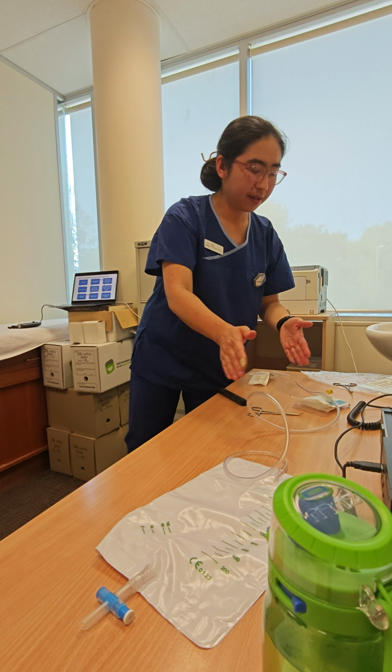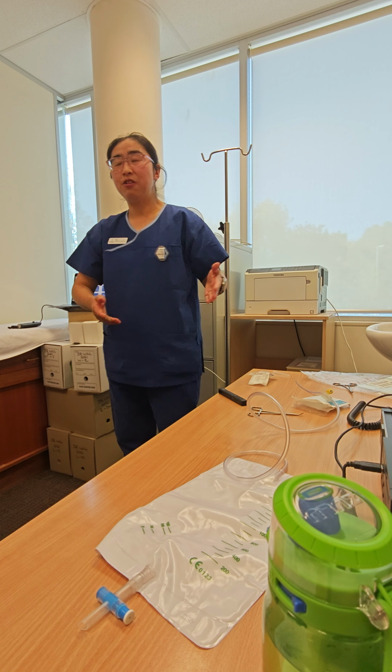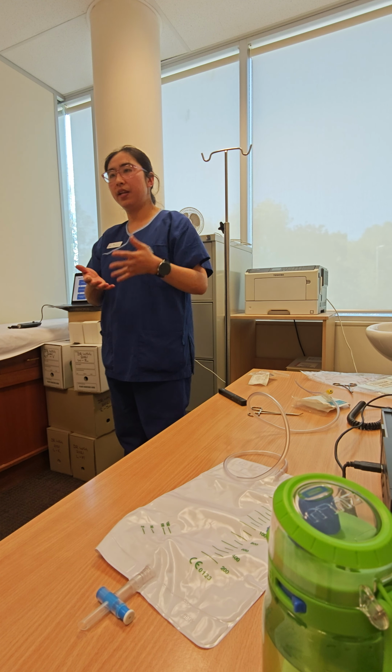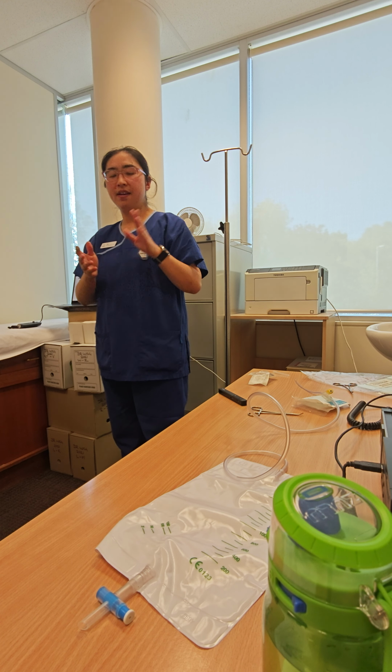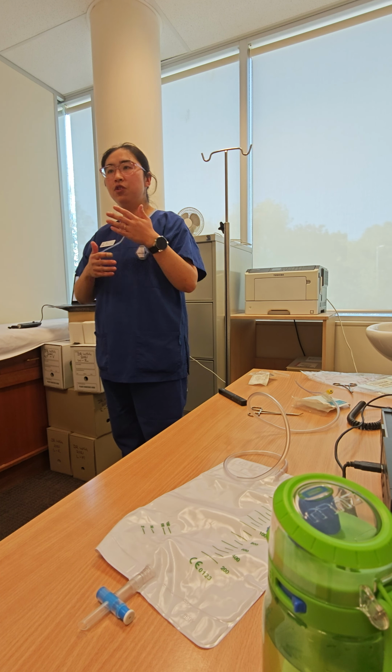Yeah, so that means the catheter is going to stay in the patient's body. We're going to tell them, okay, you need to come back and talk to your surgeon, there's a leak. You might come back again, something like that. But if it's clear, it indicates no leak.